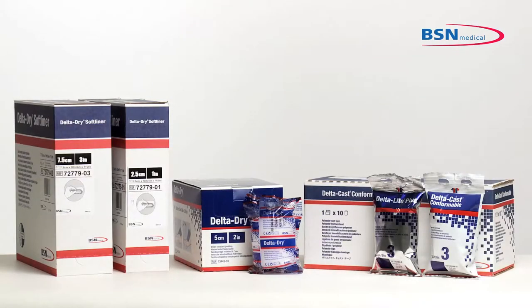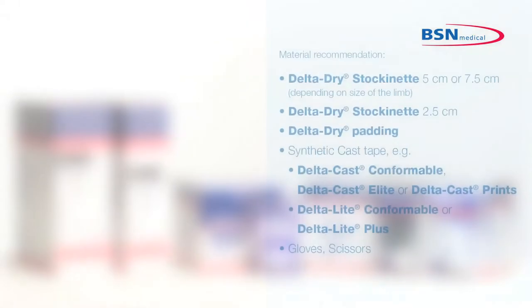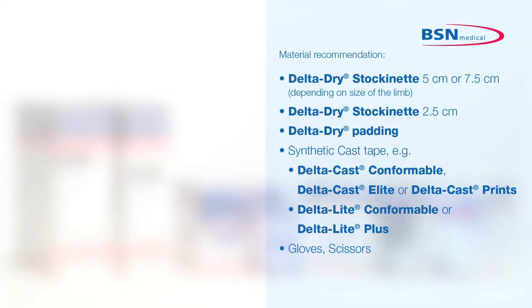Delta Dry Stockinette is a water-resistant thin stockinette intended to be used in combination with Delta Dry padding under synthetic cast tape to pad the limb and protect it during cast removal. It allows the patient to continue daily activities of bathing, washing, and swimming, should the doctor approve.